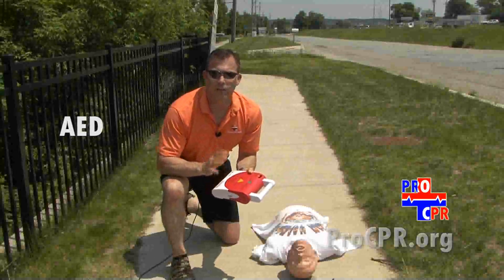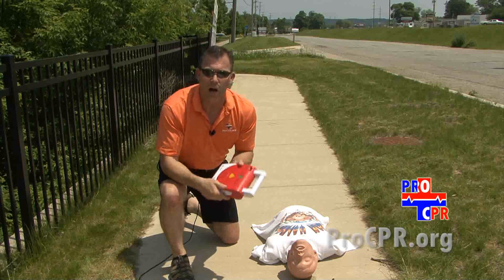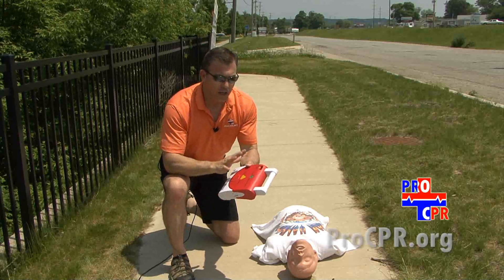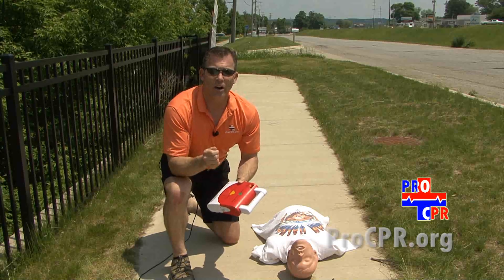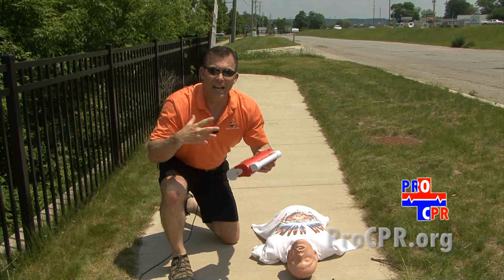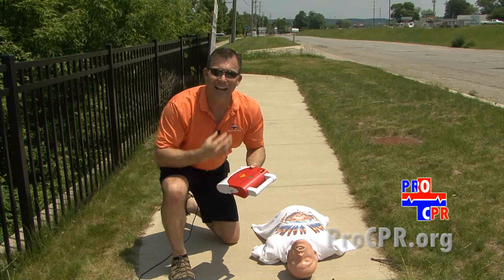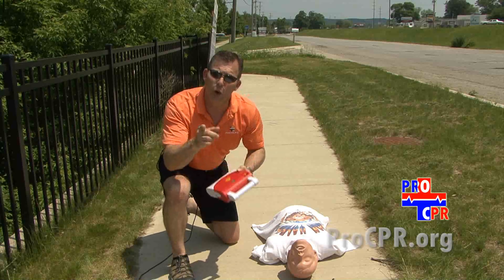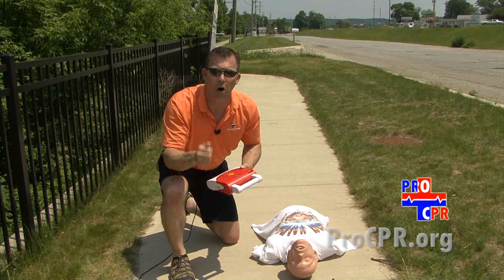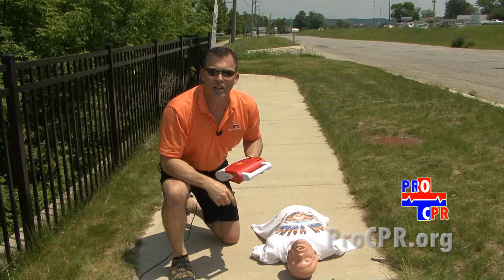More and more public access defibrillators are found in more and more places, so we thought it would be wise to include how to set up and use a life-saving AED. AEDs make a dramatic difference in cardiac arrest situations. What we're doing is taking a fibrillating heart, shocking it, so that the heart can start beating normally again, circulating blood and oxygen to the brain, heart, and vital organs. The sooner we can get an AED on a cardiac arrest victim, the better their chance of survival.